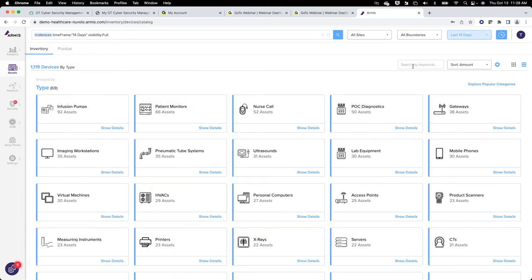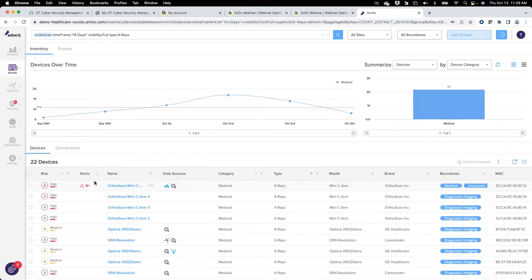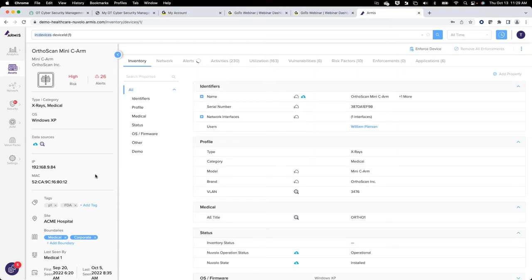And what I mean when I say that is you're going to have certain users that are frequently logging into Armis. You're going to have certain users that are frequently logging into Nuvolo. And then you're going to have this small subset that's really looking at both. At the end of the day, when it comes down to some of the technical information, a lot of times your software version and your operating system may be enough for a good portion of your techs. Those are going to be the critical elements, really, the MAC and IP addresses will be tied in on the Nuvolo record. And that information is really that baseline that most of your techs, maybe that's all they need. But then you also have those super users that are going to need to take it one step further.